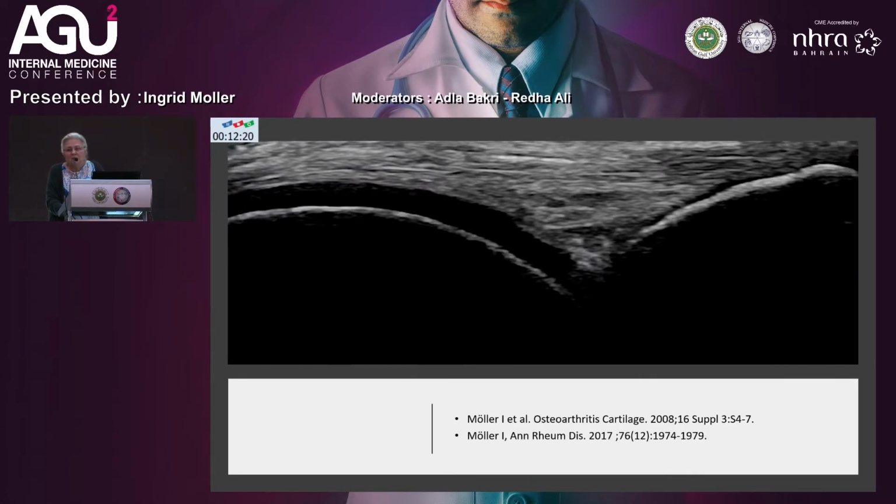And ultrasound, because this is in fact my area of interest, well, we can see the cartilage by ultrasound. And here you have the cartilage, and you saw these excellent workshops that we had in the morning where they explained about ultrasound, and we know that this is hyper-echogenicity, whereas this is anechogenicity. Anechogenicity means no echo, and this is water.